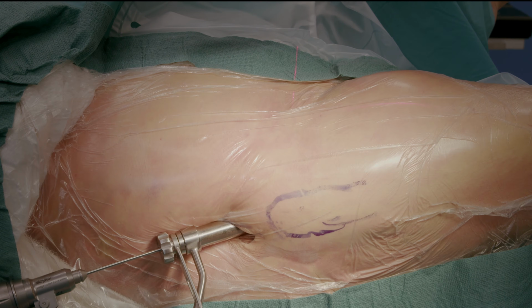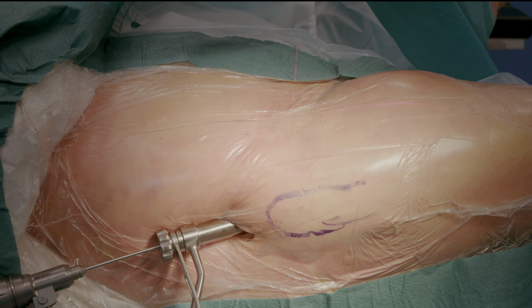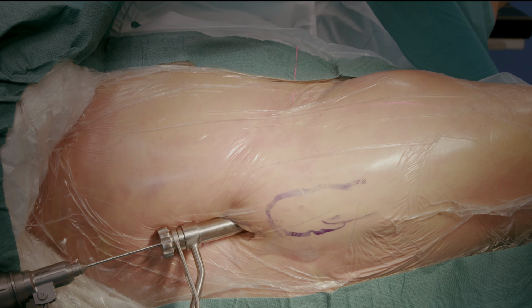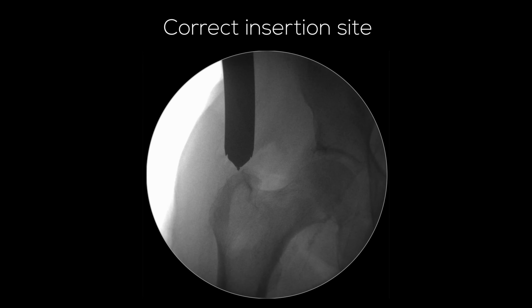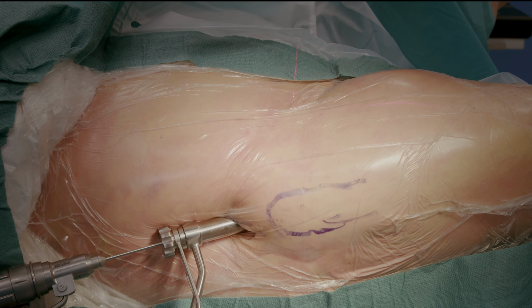In this case, if you start too laterally, the guide wire may easily end up against the medial cortex and even outside the bone through the fracture site.